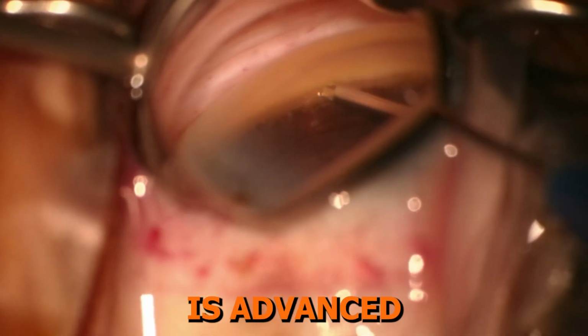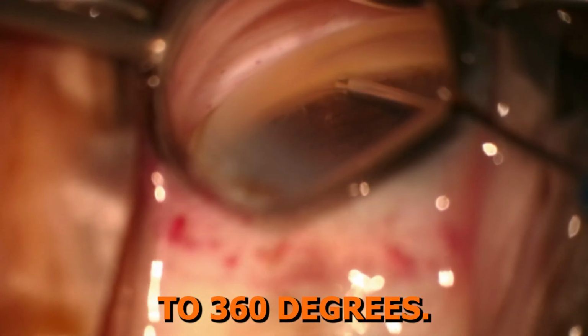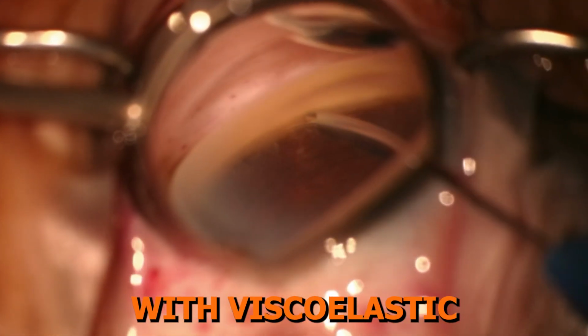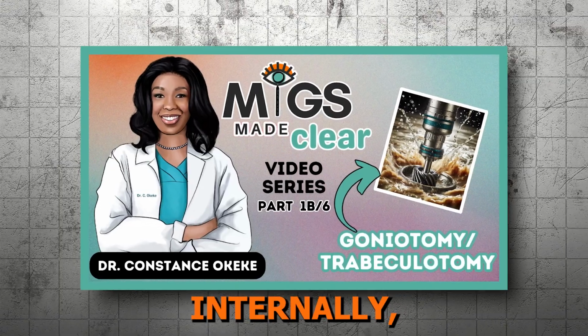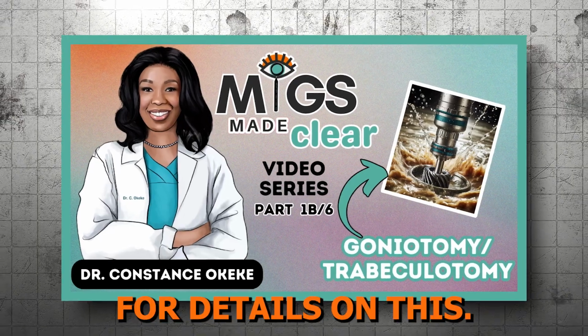The actuator is advanced and inserts the catheter into Schlemm's canal for up to 360 degrees. Then the actuator is retracted, dilating the canal with viscoelastic. Note that the iTrack device, if inserted into Schlemm's canal and pulled internally, can be used to perform GATT. Refer to MIGS Made Clear Part 1B for details on this.